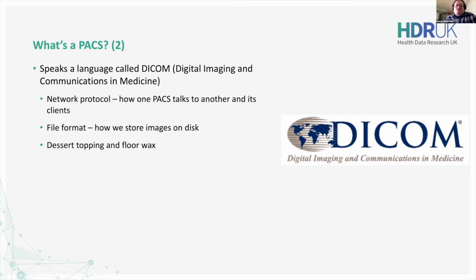So basically a standardized language and file format, which hopefully all of the equipment speaks and understands to some extent. And it standardized the file format in particular, exactly how those pixels get stored, and all these sorts of metadata, patient IDs, patient names, dates of birth, all sorts of other parameters that get tracked.